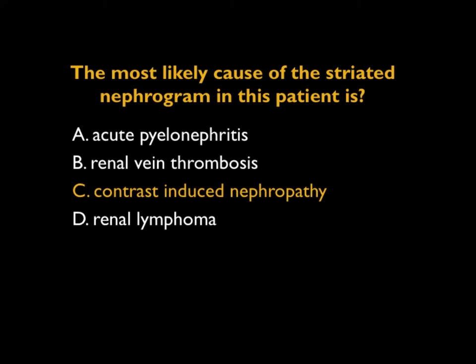Maybe the patient got a head CT and wasn't hydrated. Something happened. So again, you've got to be thinking, look at the kidneys before you scan a patient. If the patient had contrast recently, it's typically not an issue, but it could potentially be an issue. And this would be a good example of such a case.